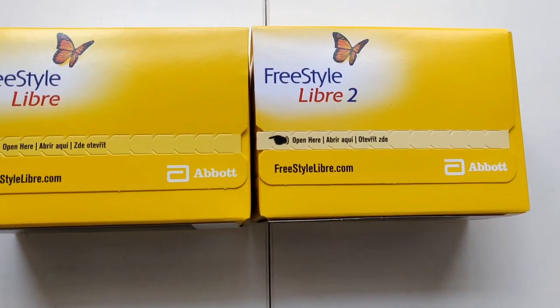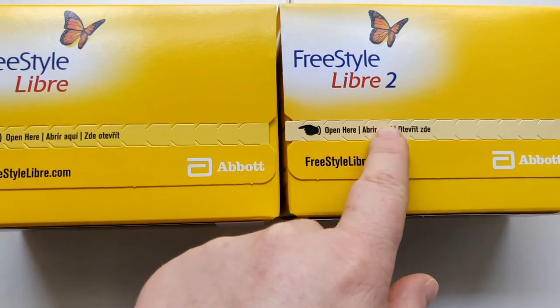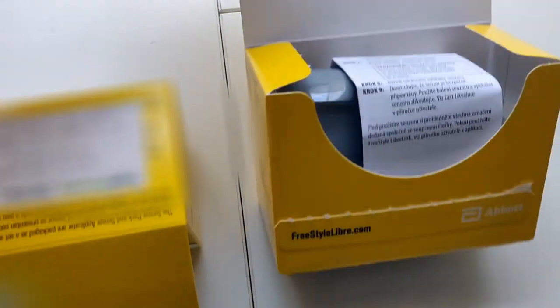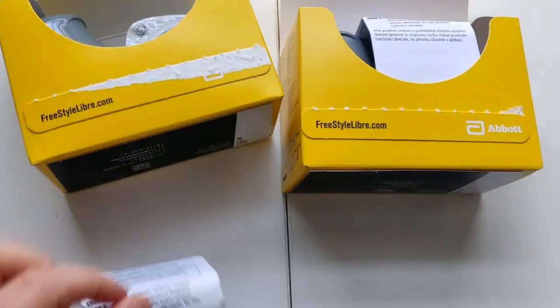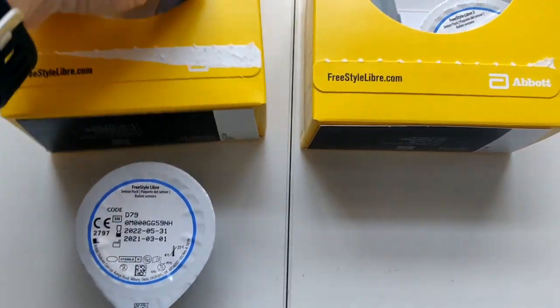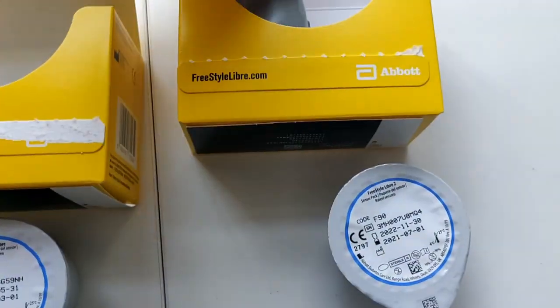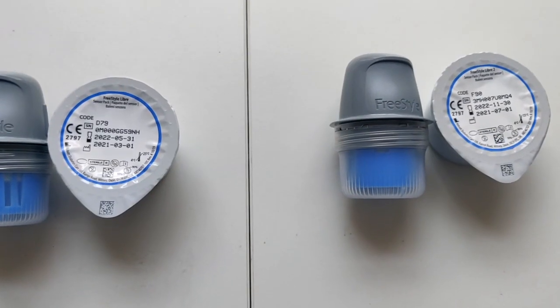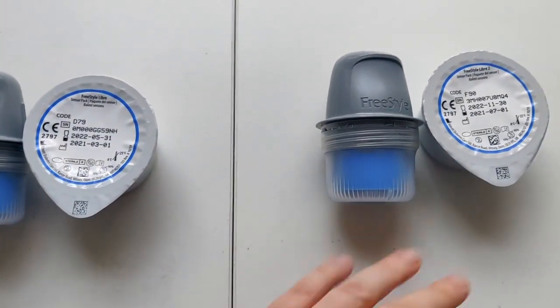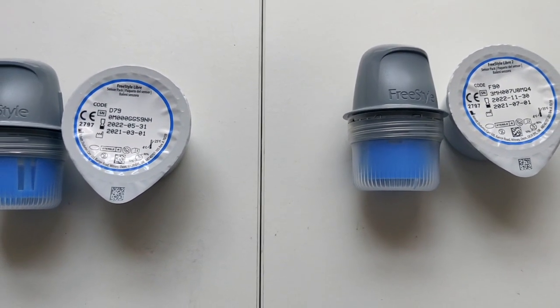Moving on to the sensors: Freestyle Libre 1 on the left, Freestyle Libre 2 on the right. There is absolutely no difference besides the '2' written on it and a slight colour difference on this part here. Opening them up, they look exactly the same inside too. We have a leaflet, the sensor pack, and the applicator for each. Even the writing on the applicator just says 'Freestyle' — it doesn't indicate which is Libre 1 or Libre 2. So let's put them on and see if the application process is exactly the same.